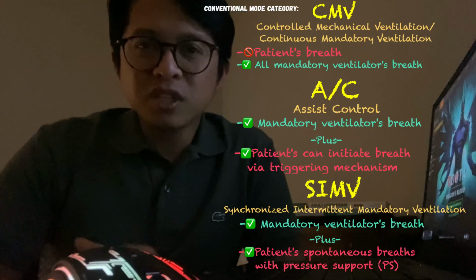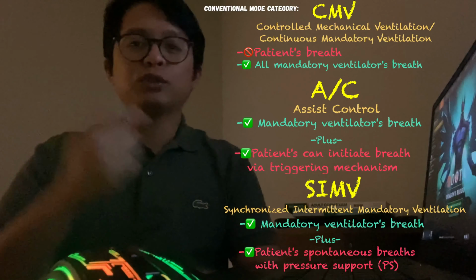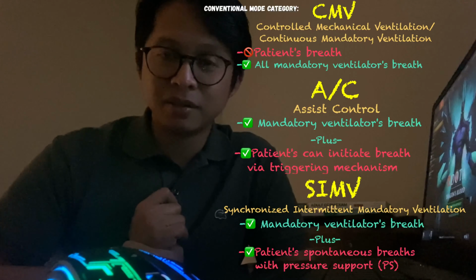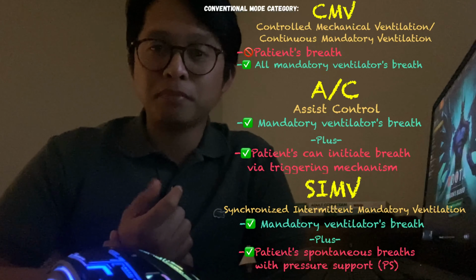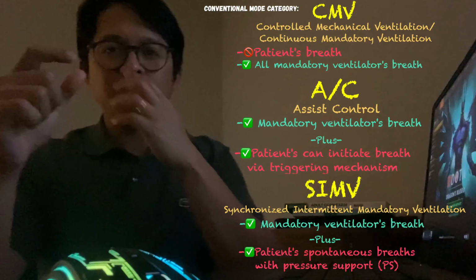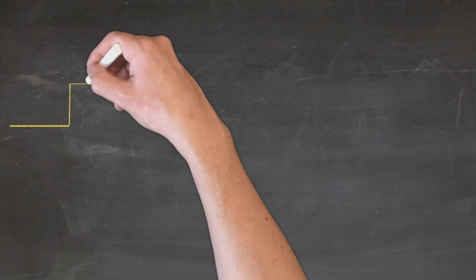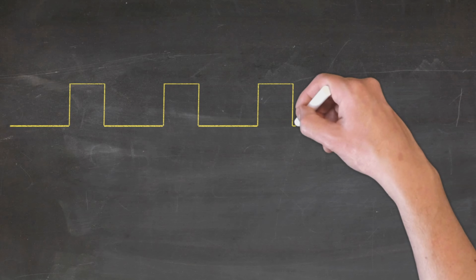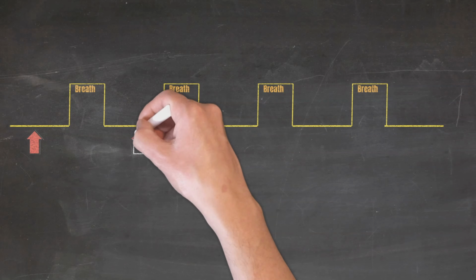In between those 10 seconds, the patient is allowed to breathe spontaneously, not a trigger breath or a ventilator breath, but a patient breath, his or her own breath. Let me give you an illustration. This is the breath that the mechanical ventilator is giving mandatorily. In between this, the patient is allowed to have his or her own breath.